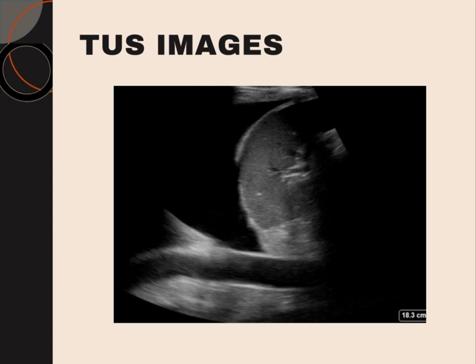So this actually reflects the pleural fluid collection, and normally we measure the size and depth of the fluid according to the numbers, how many centimeters, and sometimes we measure the rib spaces, how much fluid there is, and what the ideal intervention is, what is the maximum point where we need to intervene. That is just to get an idea. Next images.